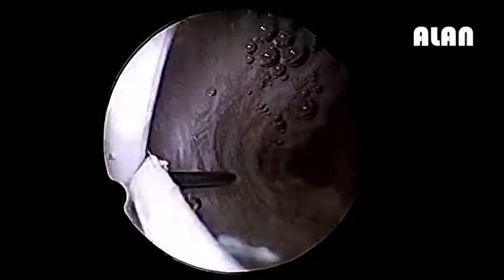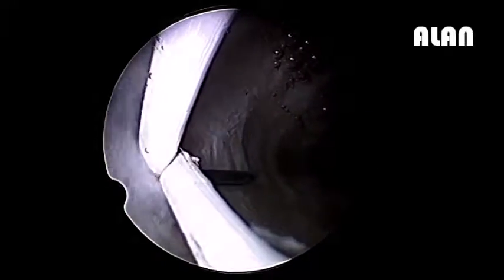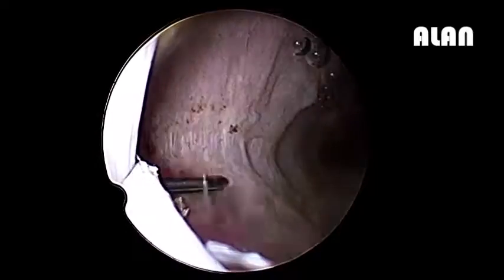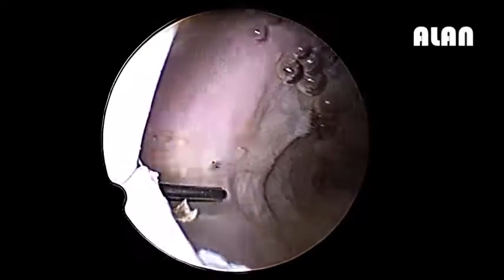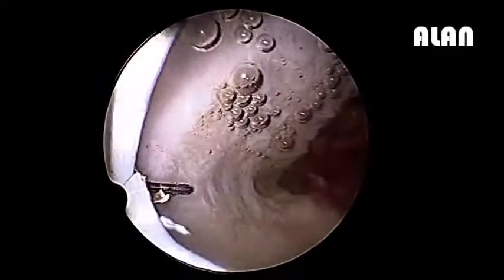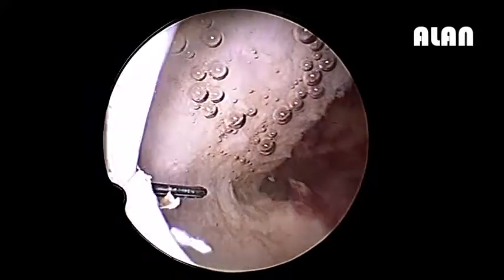Now we are going to put a Foley's balloon here. You have seen it's a larger cavity, so we generally put an 8 to 10 French balloon. I am talking about Foley's catheter — we generally put a pediatric Foley's 8 to 10. Can we reduce the pressure?